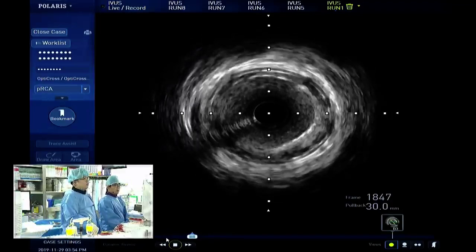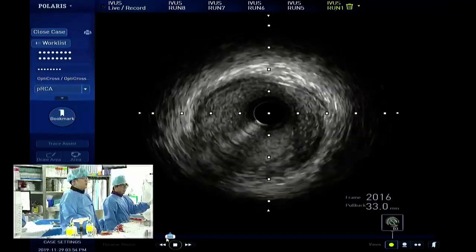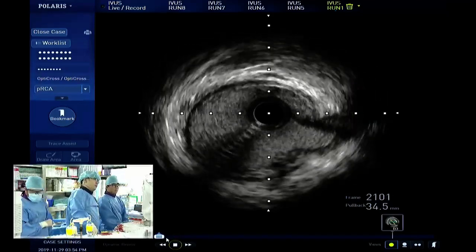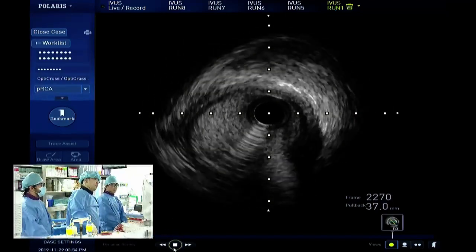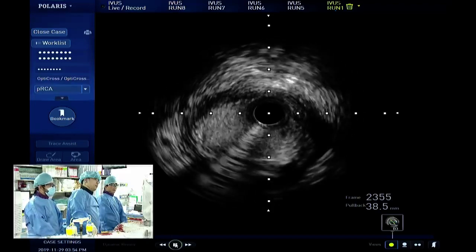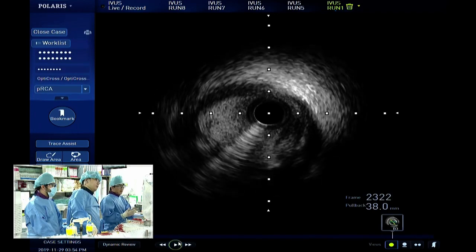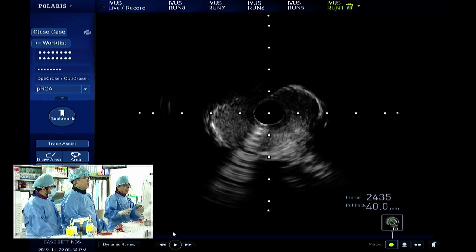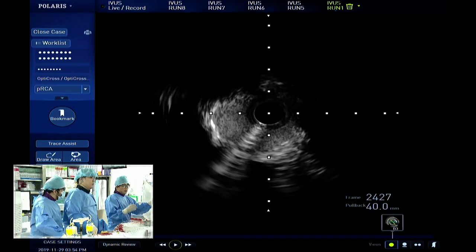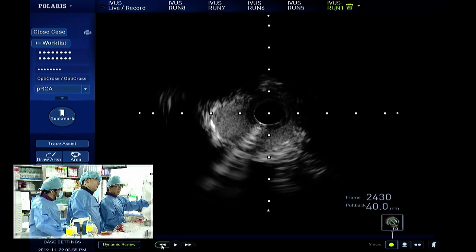And this portion is at the proximal, I think. Okay, this is the proximal portion. Let's see the ostial part. Some branches here. And this is the ostium. Actually, there was a dense calcium at the starting point of the ostium. We did not see it fully at the proximal, but we thought that a 38 millimeter stent would be sufficient for this patient.